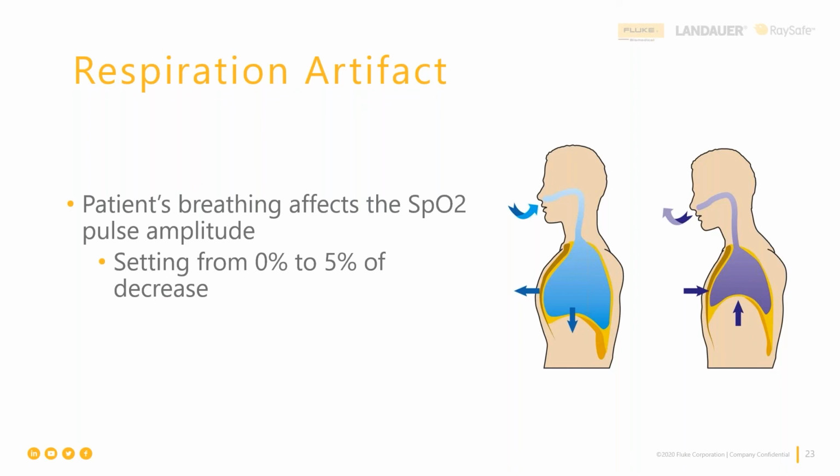Now, when would we use artifact settings? Mostly, they would be used if we have a problem reported by the doctor or the nurse that says, hey, I'm just not getting really good readings on this last patient. We would like to know a little bit more about that last patient. So what we do is we would then introduce the artifact to see what kinds of things were going on with this pulse oximeter for the clinical situation in which it was being used, and the doctor or the nurse complained it wasn't giving the right measurement. It's a troubleshooting tool.